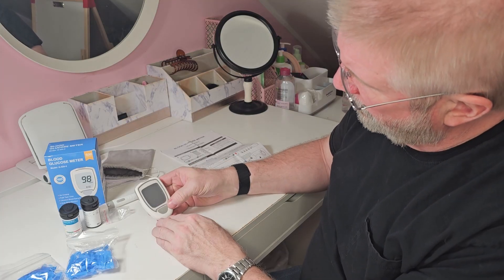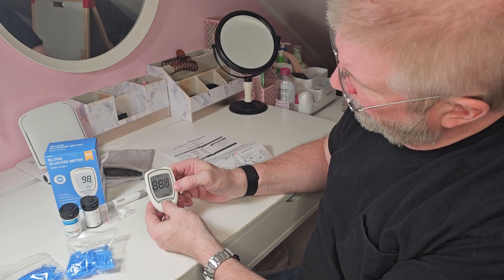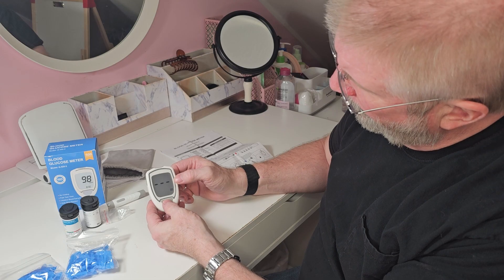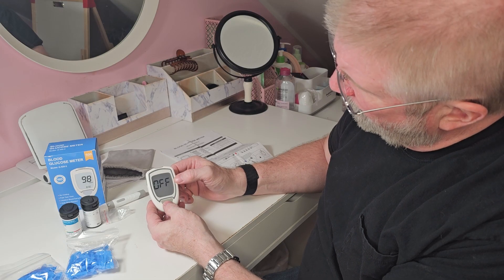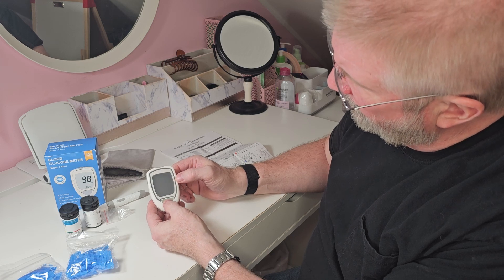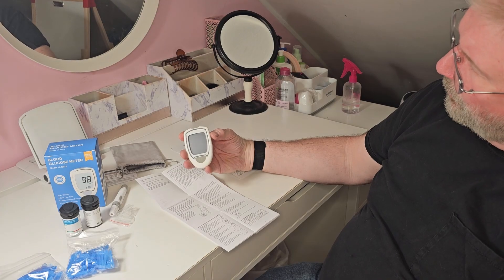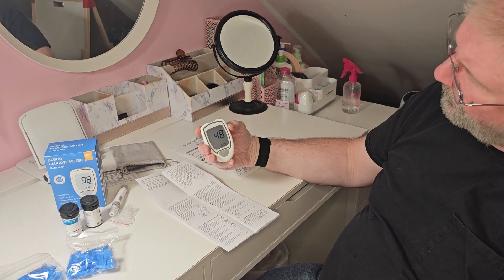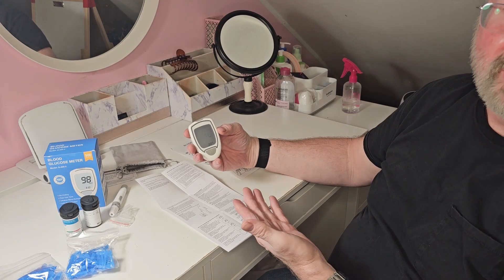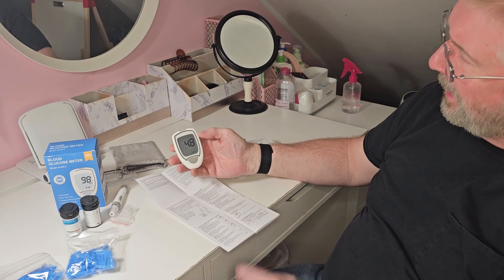You put the cover on and that basically turns it on for you. Then you want to set up the time and date because it does have a memory. To set the time and date, hold this top button in for about three seconds and that'll turn that on. Hit memory and that will go to your date.